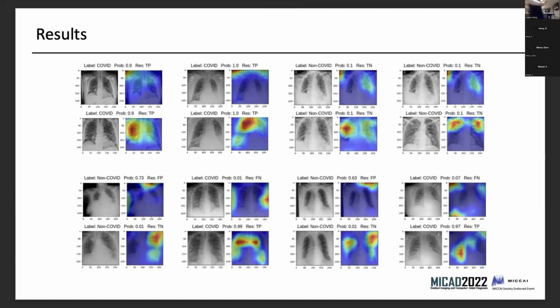Right, these are some interesting results here. On the top row, you can see the raw images again, and on the bottom row, you can see the pre-processed images. An interesting thing that we noticed, using GradCam to see where the model focused to do its predictions, is that our pipeline actually improved the focus of the model on areas of the lung that are actually pathological.